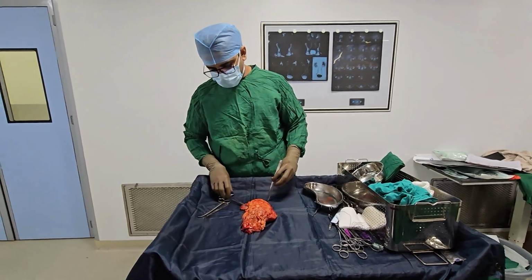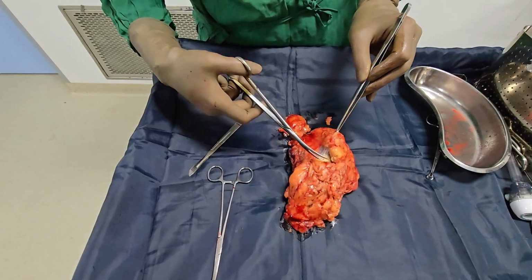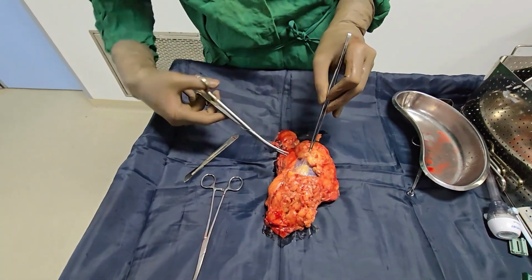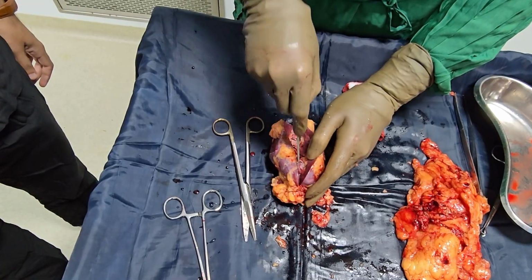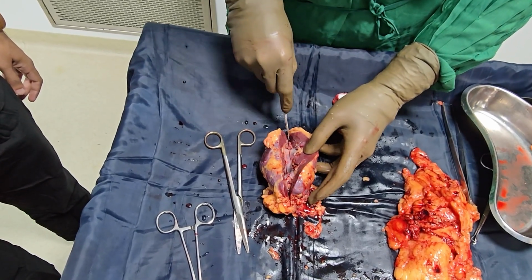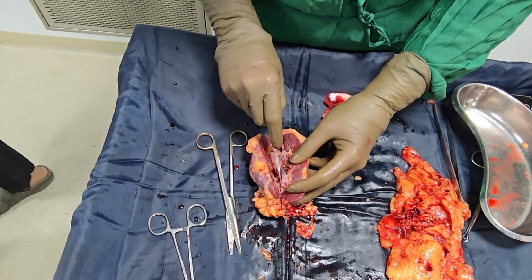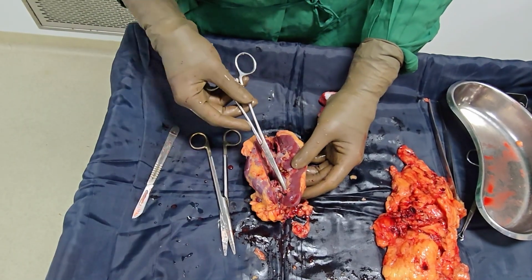While the closure is being performed, I have a habit of cutting open the specimen to see the interesting findings and correlate what I saw in the CT scan. So the specimen was bivalved here, and the pelvicalyceal system is being cut open. Now I want to see where the tumor is and what the morphology of the tumor looks like.